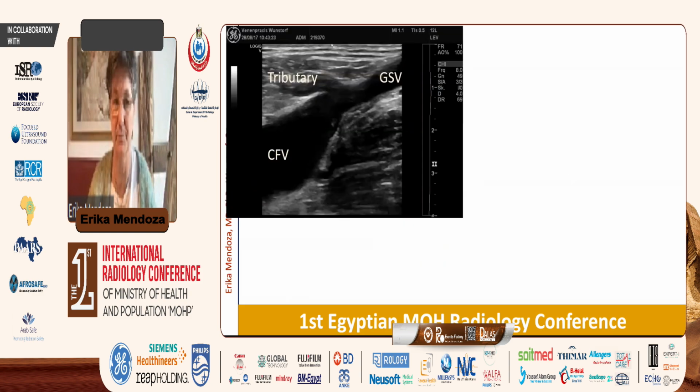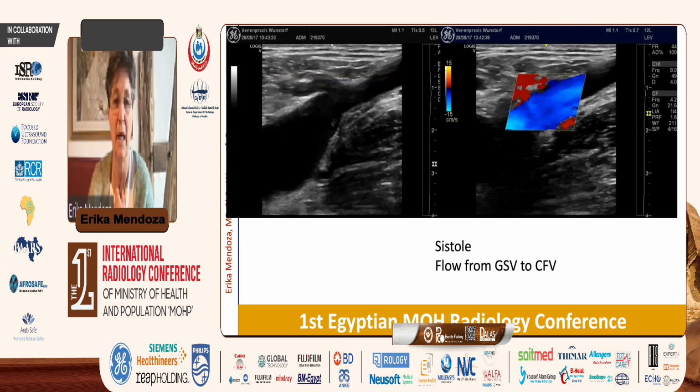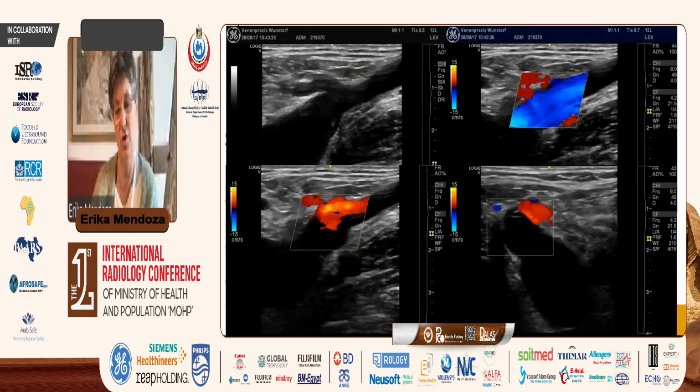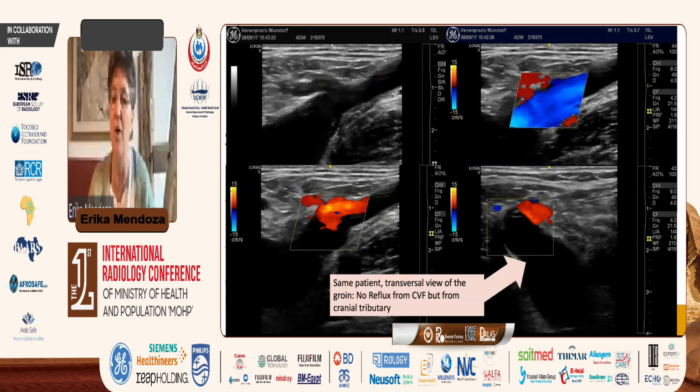Just as a reminder, we have this situation: tributary, great saphenous vein and deep vein, and this is a systole where the flow goes from superficial to deep. This is the diastole where we have no reflux from the deep vein, only from the tributary. And this is the cross-section of the same patient. Here is no reflux. It is only from the tributary. And this is very important as an indication for future thinking of how to treat patients.